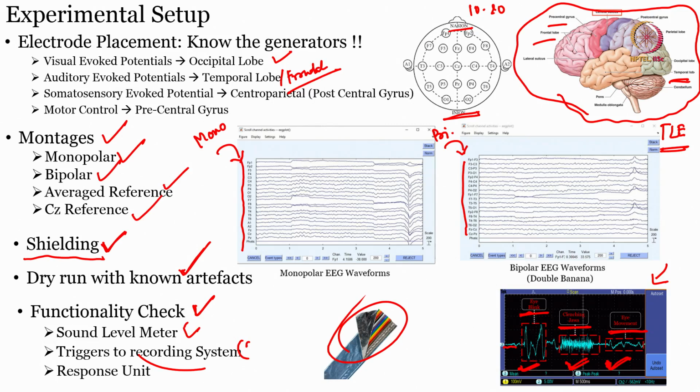Here I have given an example of a sound level meter. It is true for visual stimuli as well. There are even ethical experimental protocols designed for brain stimulation related projects. So how much current is allowable, all this you can explore before starting any experiment, right?